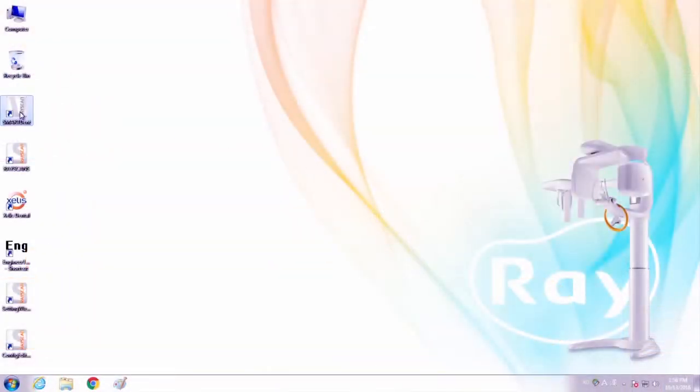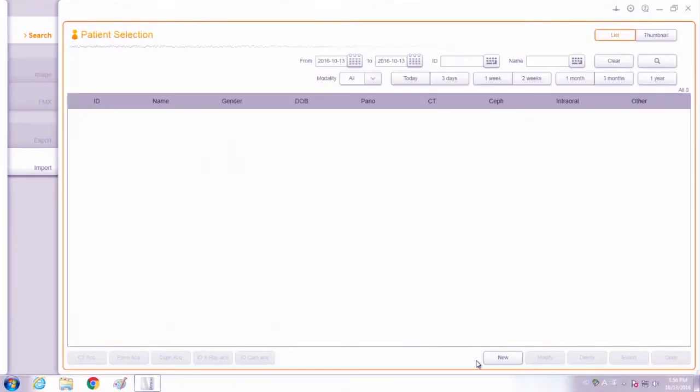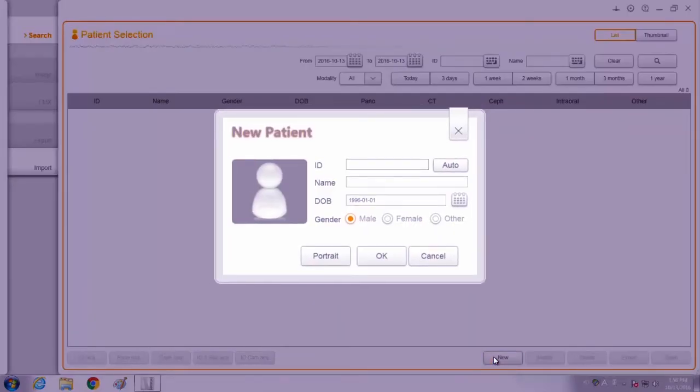Please execute Smart Dent and register the patient information. Click the new button and then enter the chart number, name, birthday, and gender of the patient. Then click OK to complete patient registration.